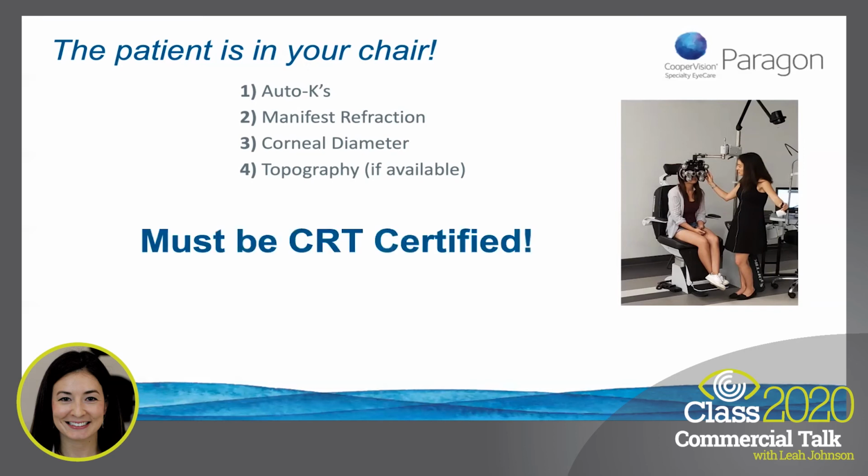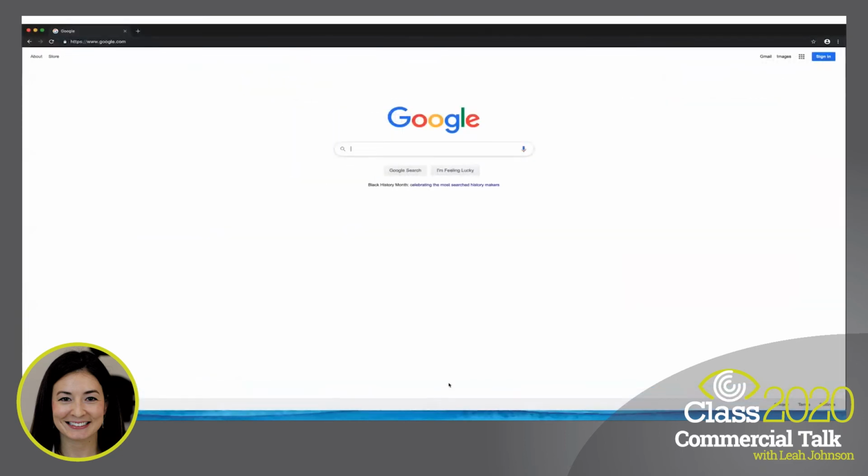You must be CRT certified. Don't forget, to dispense and prescribe CRT lenses, you must have an FDA-approved certification. So, the first thing you will want to do is download our lens calculator. Here's a video to show you how to do that, starting with Google.